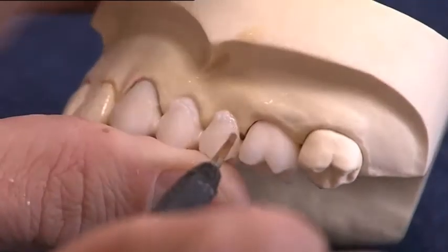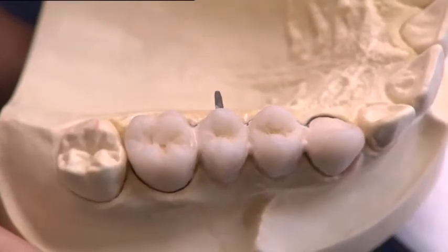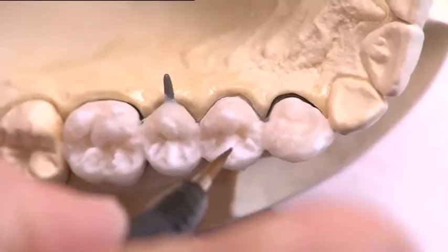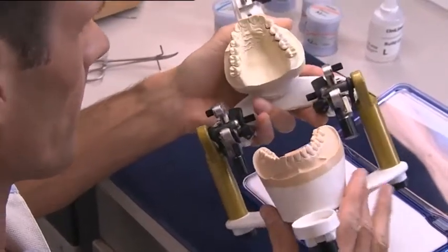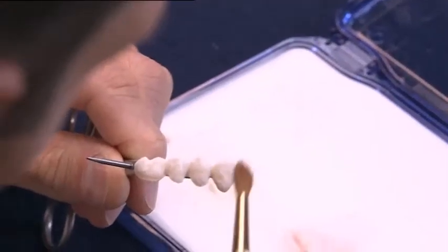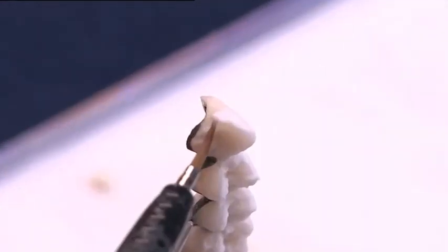Missing areas and proximal contact points are filled with dentin incisal materials. For opalescent effects, the materials from the Impulse kit are available. Fit and function are checked in the Stratos. The ceramic surface can be pre-densified by running a large dry brush over it.